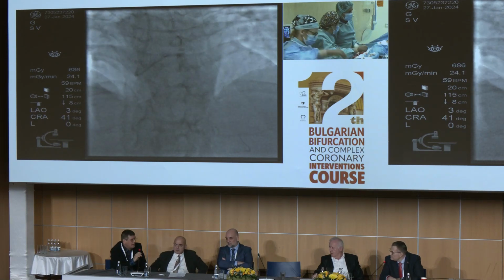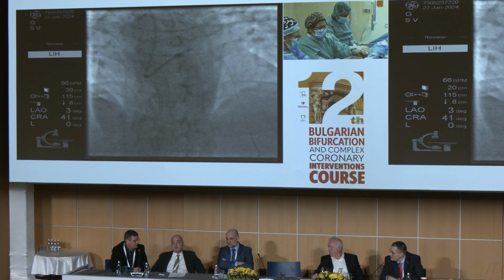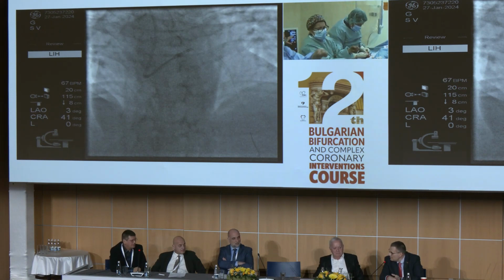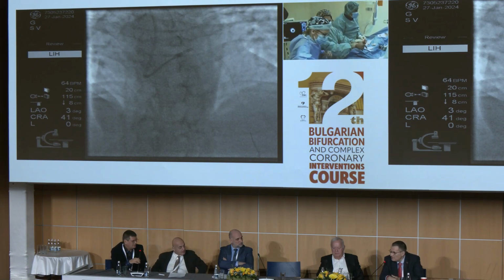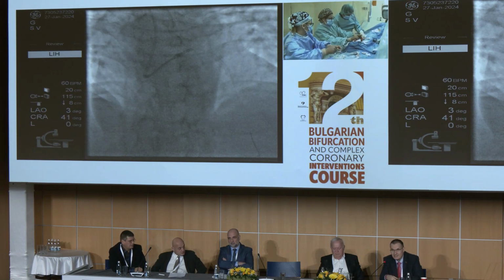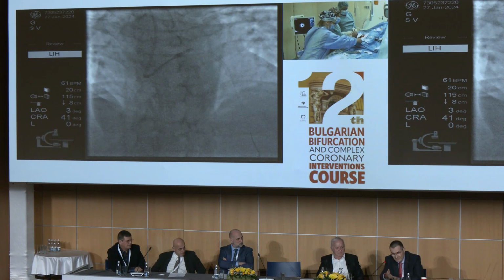Professor Vasiliev, can I ask you, did you make this on a bench test? Yes. It is published in this article in the cardiology journal. You can see the bench. Okay. We made it with Orsiro stents. Actually, by the way, exactly with the Orsiro which they use. I mean, not this one.